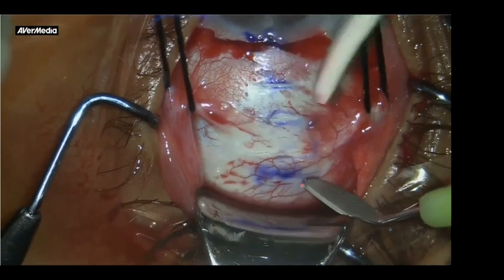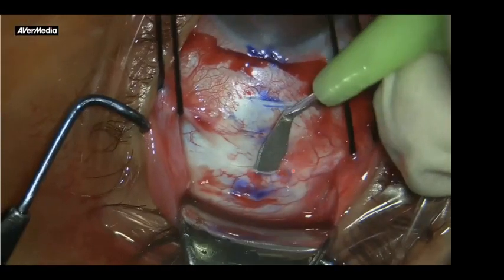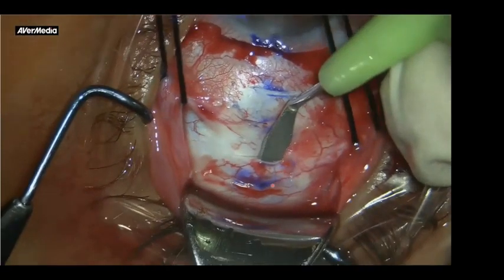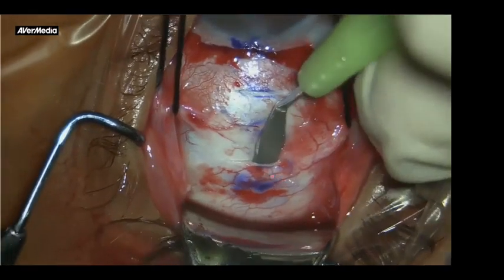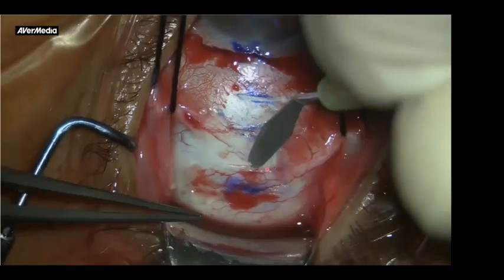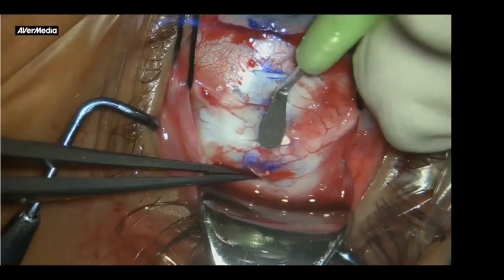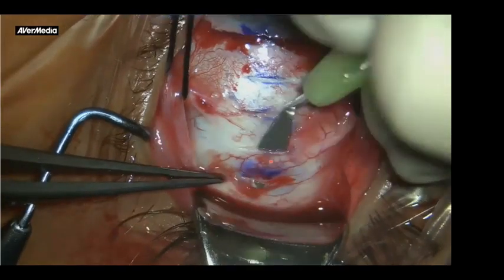And then after I did my incisions, again, dissecting the posterior tunnel, I found it easier to have the direction of the crescent from proximal to distal, so from the cornea backwards. This is much more convenient. Yes, you can do it from backward forwards, but again, I found this one is convenient for me.